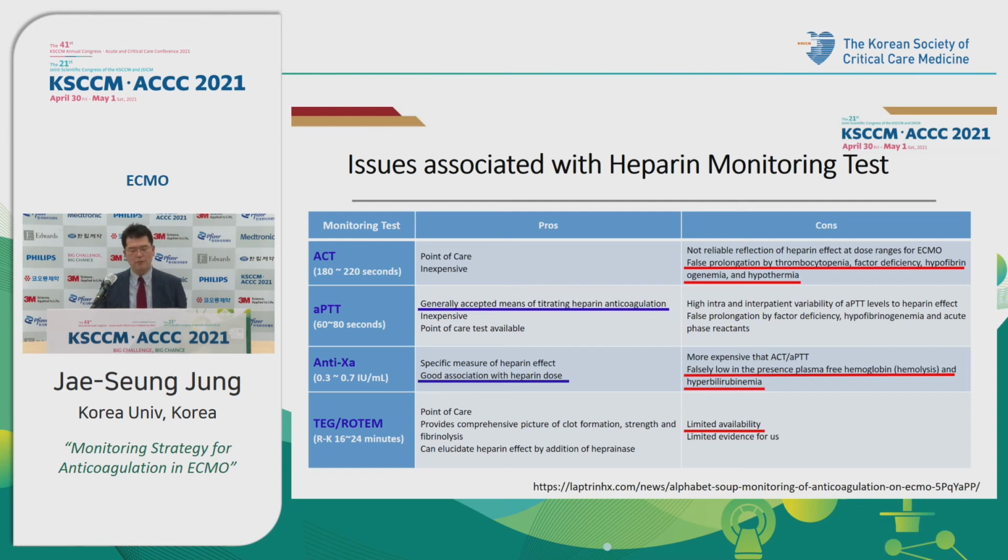TEG and ROTEM are very good sometimes, but many centers have no such device. But in some cases, such as trauma-induced coagulopathy and DIC, we can use this device for the patient, and we can get a very good result.